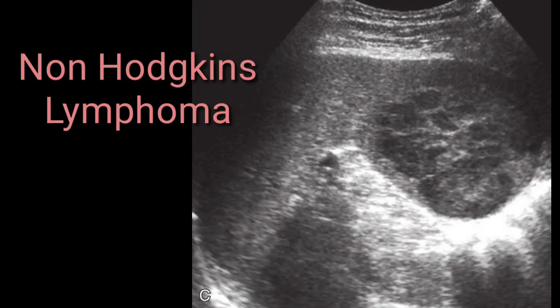Usually in this case there will be multiple organs involved. There may be nodular lesions in the spleen, in the liver. Lymph nodes would also be enlarged. Lymph nodes of other areas, especially the groin region, inguinal region, and the neck region would definitely be involved. In this case, you can see a well-defined hypoechoic mass with a cystic lesion arising from the upper pole of the spleen. So this is non-Hodgkin lymphoma.